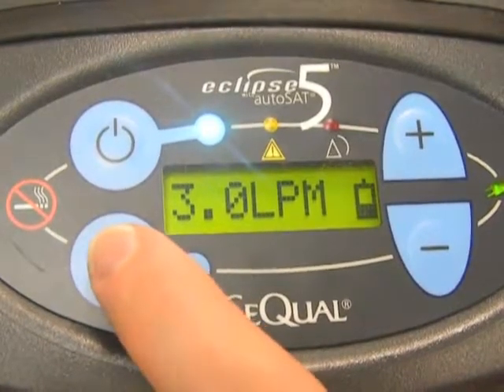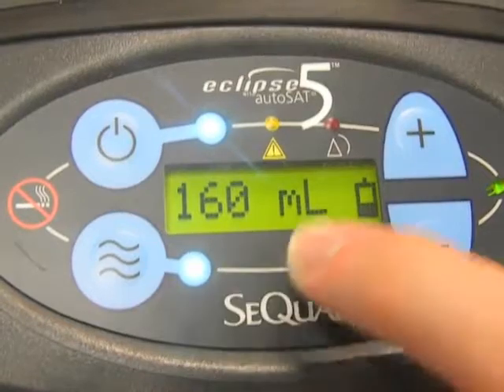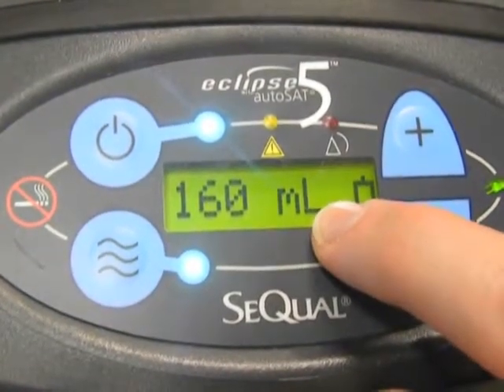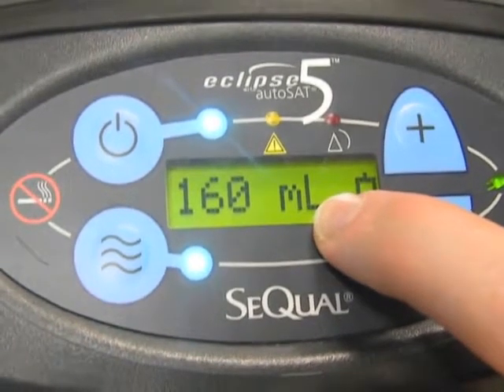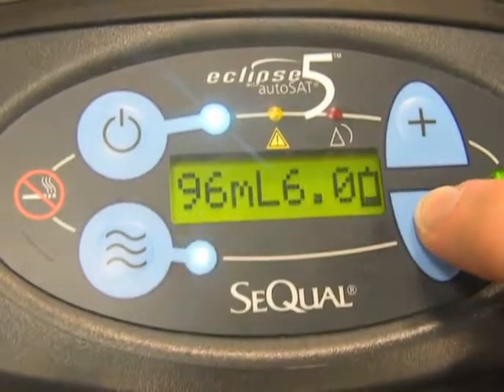Once you press this button, the light next to it will light up, indicating you're in pulse flow, and the screen will change from liters per minute to milliliters. This indicates the size of your bolus, or each puff of air that you receive when you breathe in. Again, you can adjust the flow by going up or down.